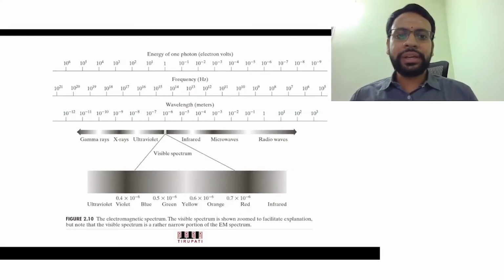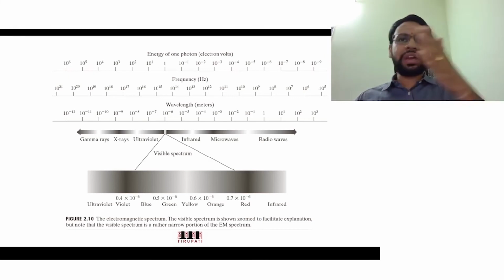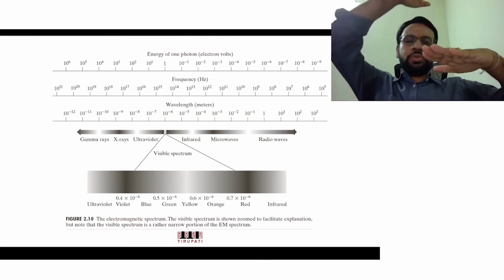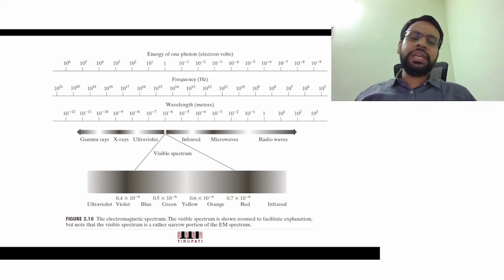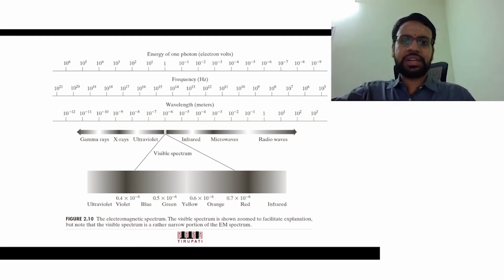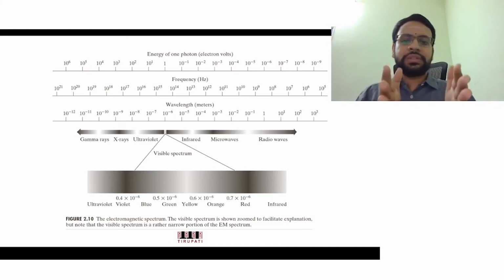Let us now take a look at these modalities from the electromagnetic spectrum point of view. So you could see here, in terms of energies, if we start with the visible spectrum, above the visible spectrum you have the ultraviolet spectrum, right? UV rays, X-rays, and gamma rays, and below that you have infrared, microwave, and radio waves. So can you think of any imaging modality that uses the light in the visible spectrum? That is endoscopy. Some of you might already know about it. It's like a small visible camera sent inside in endoscopy, and then they take a look at how various organs are there, right? That's in the visible spectrum.